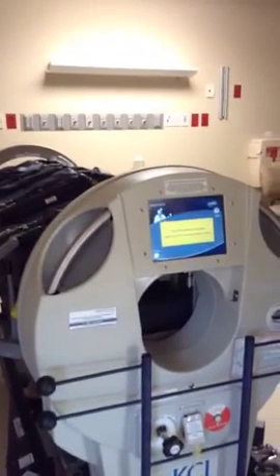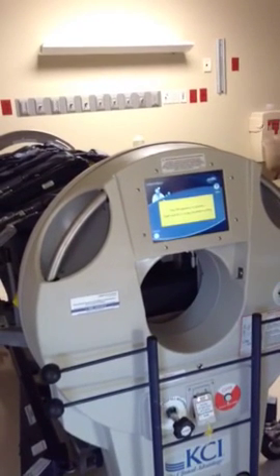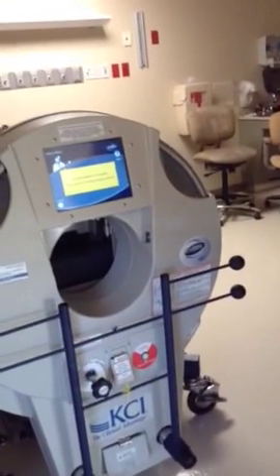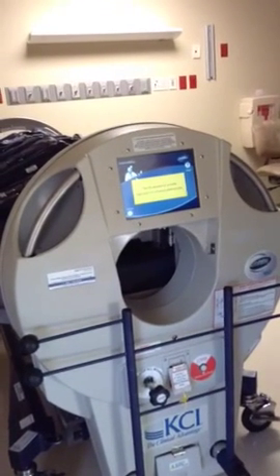Position and they shifted, and you get that alarm that keeps saying there's a buckle or a hatch that's open, and you know they're all closed, but it won't let you do anything. If you press and hold this button, it will override that, and the patient will come back to the center. So get them over to the center where you can get the alarm to go off and then crank them in. Does that make sense?